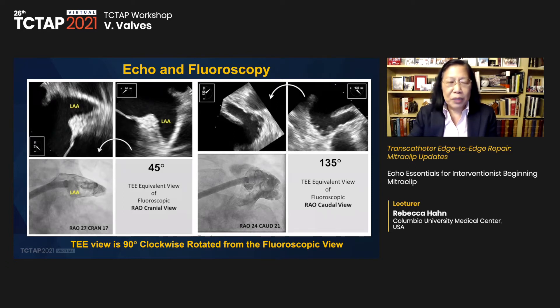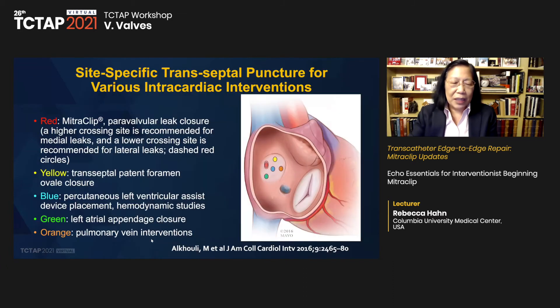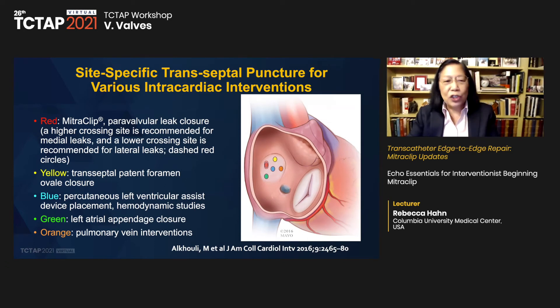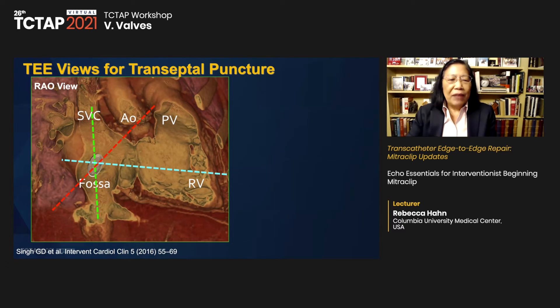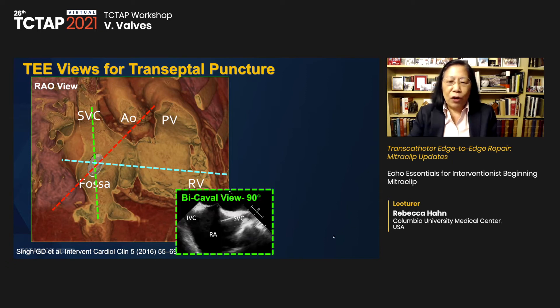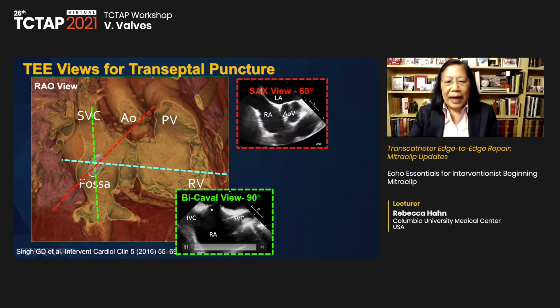By rotating the clip and the imaging plane, we continually watch the clip arms rotating into the correct position. With the G4 device and its independent grippers, the interventionist must identify the tactile gripper line. An example shows the anterior gripper line being released and the clip arm coming down. Whether on three-dimensional or two-dimensional imaging, it's important to be able to see it well and remember which line is which. We then advance the clip below the leaflets while maintaining orientation.